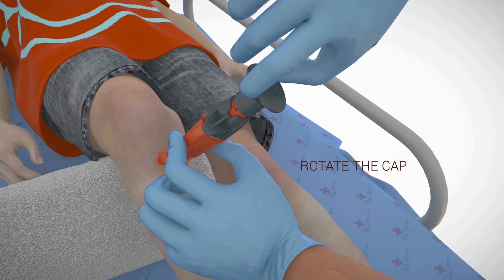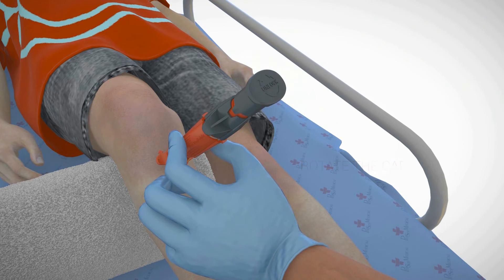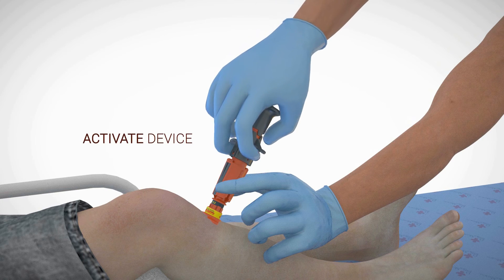Rotate the cap 90 degrees in either direction to unlock the NeoP. To activate, press the device against the skin with the palm of the hand. While maintaining downward pressure, pull the trigger wings upwards.